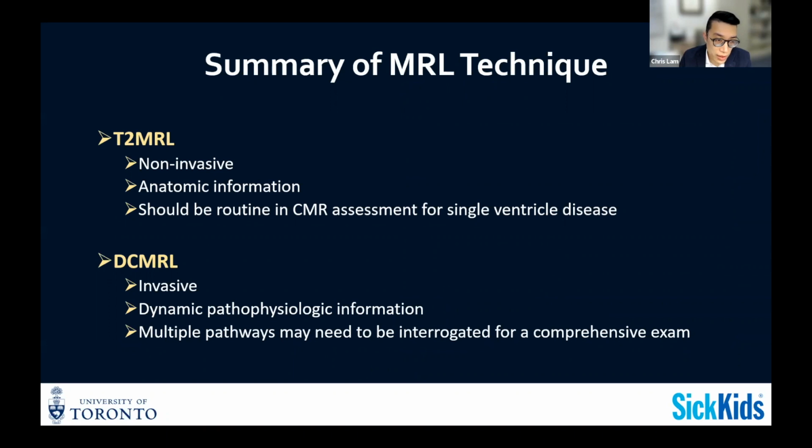the T2-MRL technique is non-invasive. You can run it on any routine cardiac MRI. It gives you anatomic information only, but is very simple, and you can run it today if you wanted to. The DCMRL is invasive. It requires more specialized expertise, but it provides dynamic pathophysiologic information, which can help guide treatment.